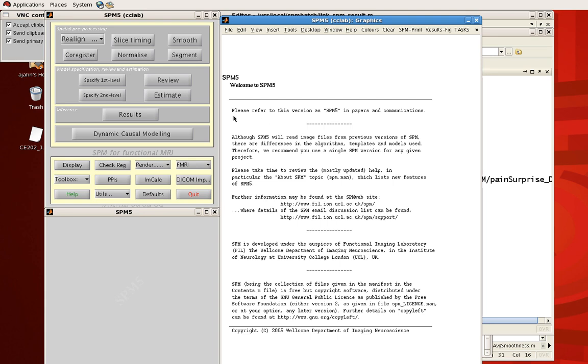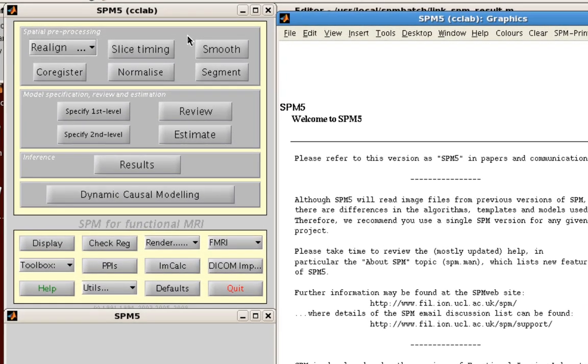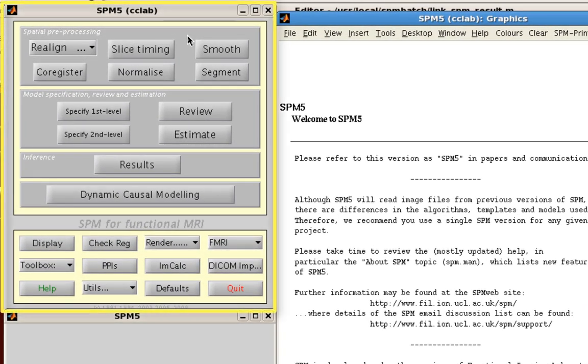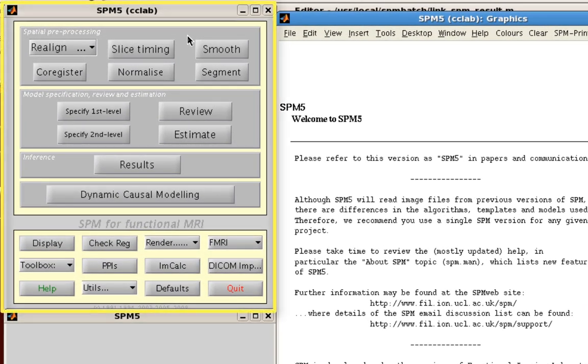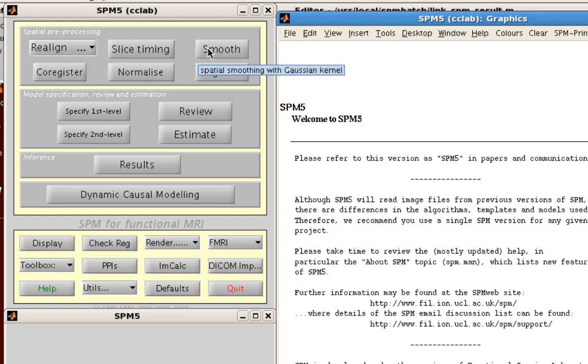So there are three panes here you should be familiar with. This one on the top left contains all the buttons which you'll be using to do and carry out all of your pre-processing and results analyses. So for example you can see that they're bounded to separate them. Here we have spatial pre-processing so that includes stuff like slice timing, realigning your images, normalizing your images, smoothing them, all of that.